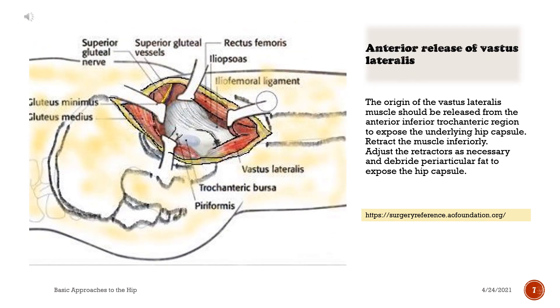Anterior release of vastus lateralis. The origin of the vastus lateralis muscle should be released from the anterior inferior trochanteric region to expose the underlying hip capsule. Retract the muscle inferiorly. Adjust the retractors as necessary and debride periarticular fat to expose the hip capsule.